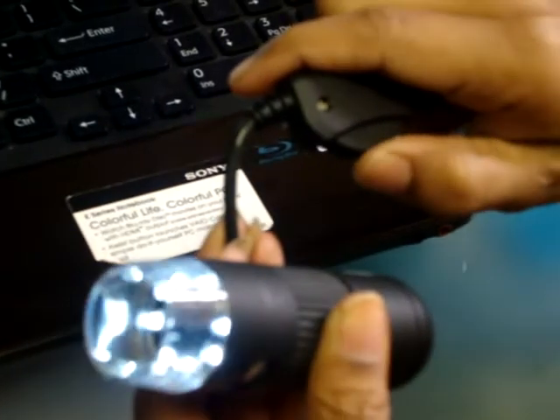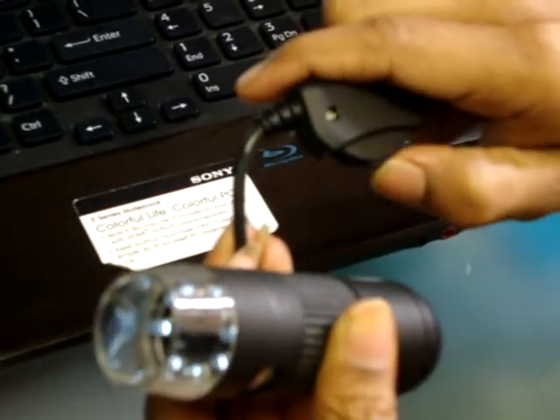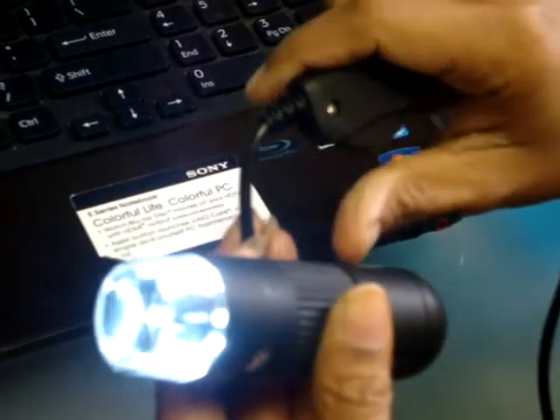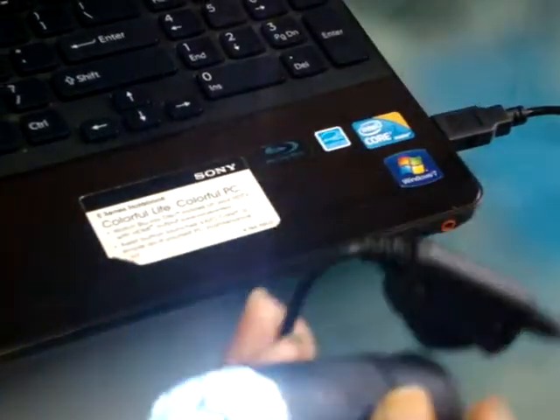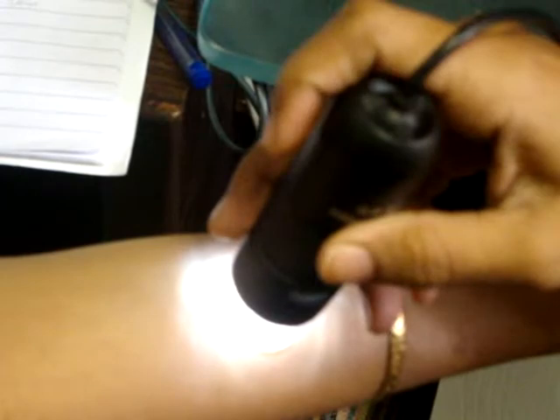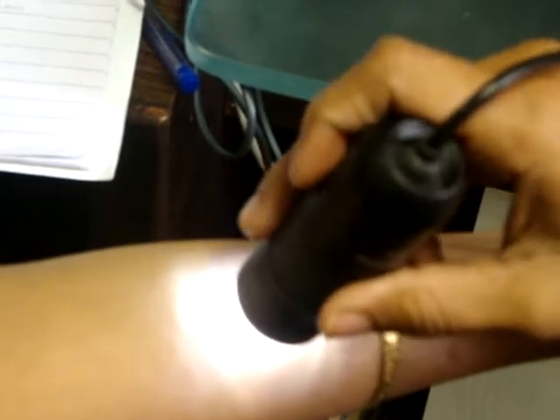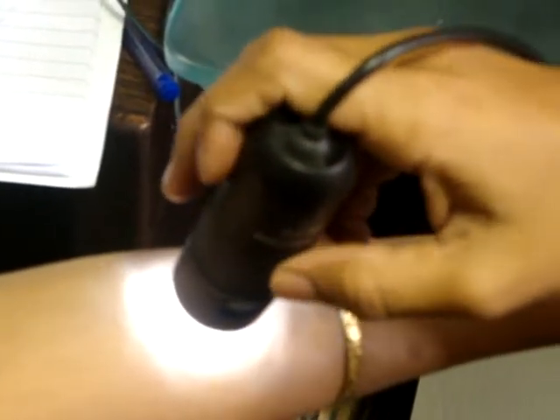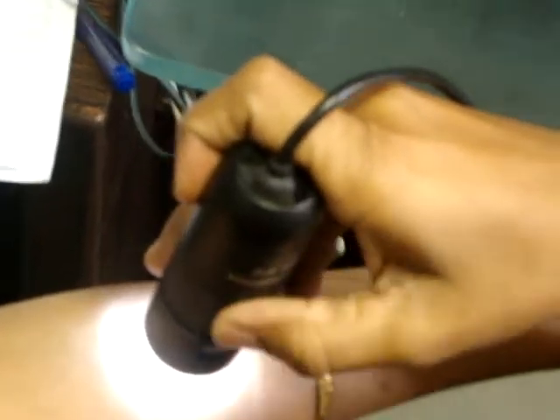Now, holding the dermascope, we focus it on the place which requires to be diagnosed. You now rotate the roller for getting a clear magnified image.